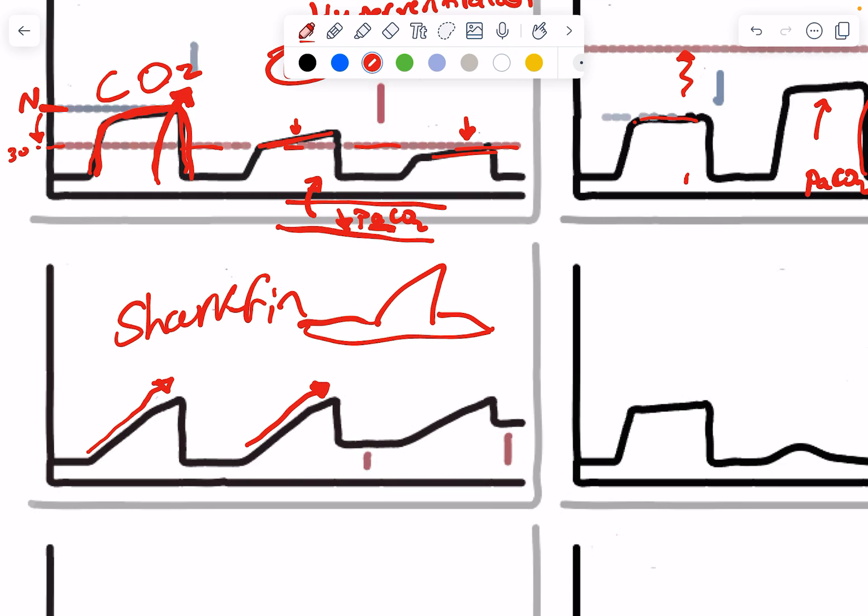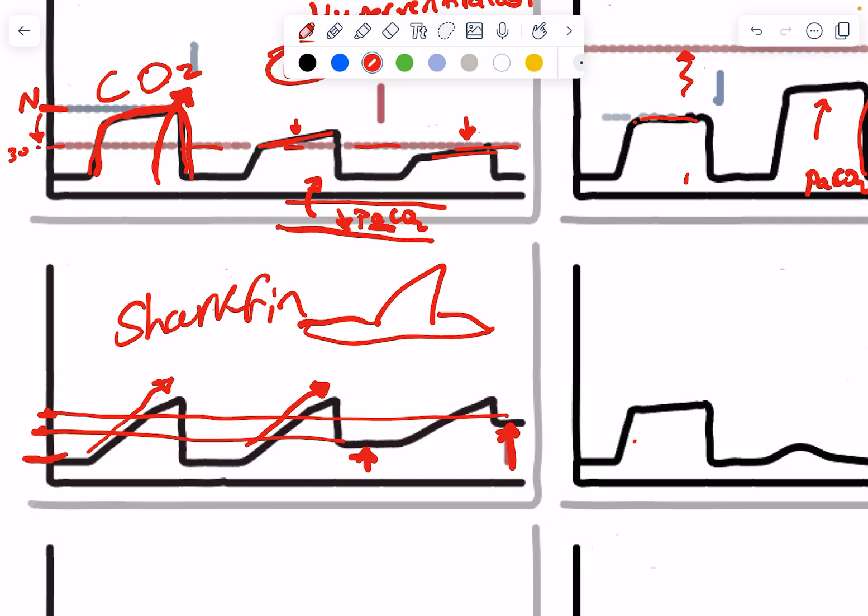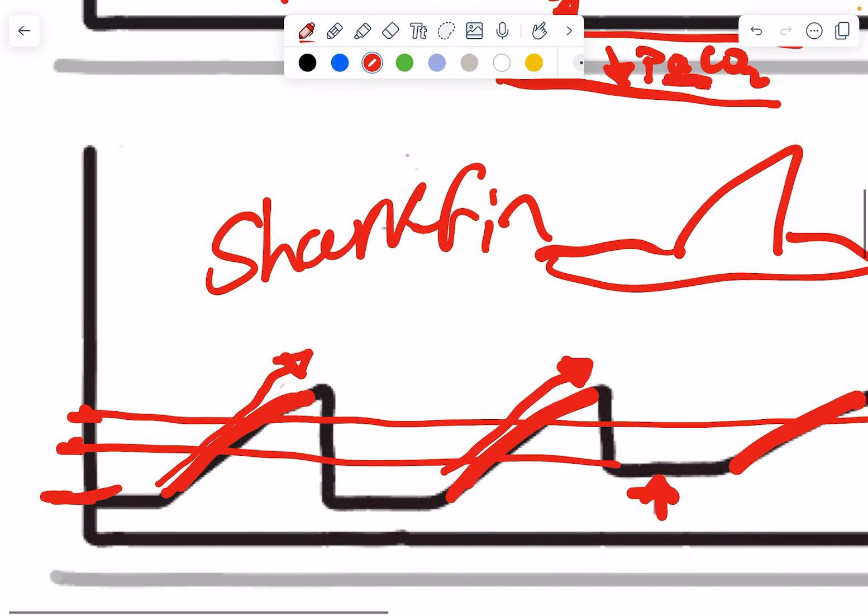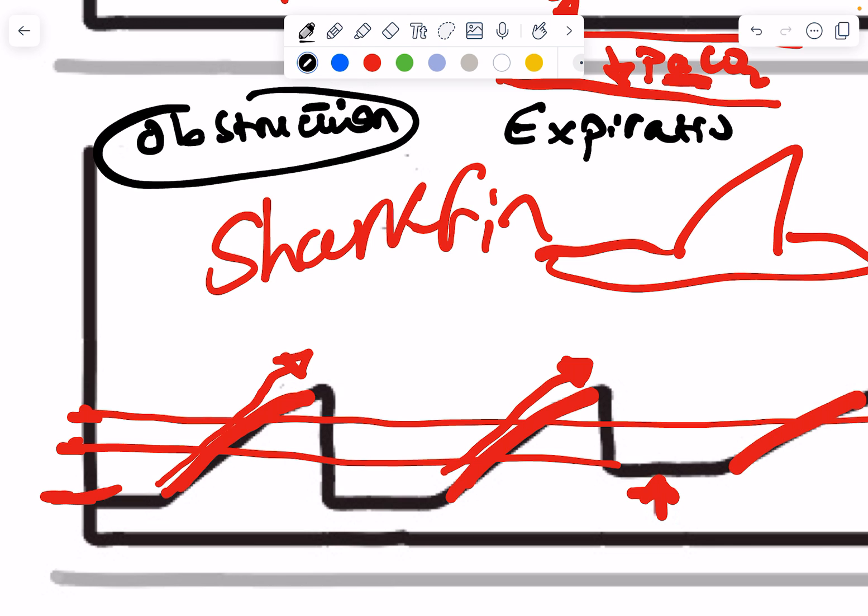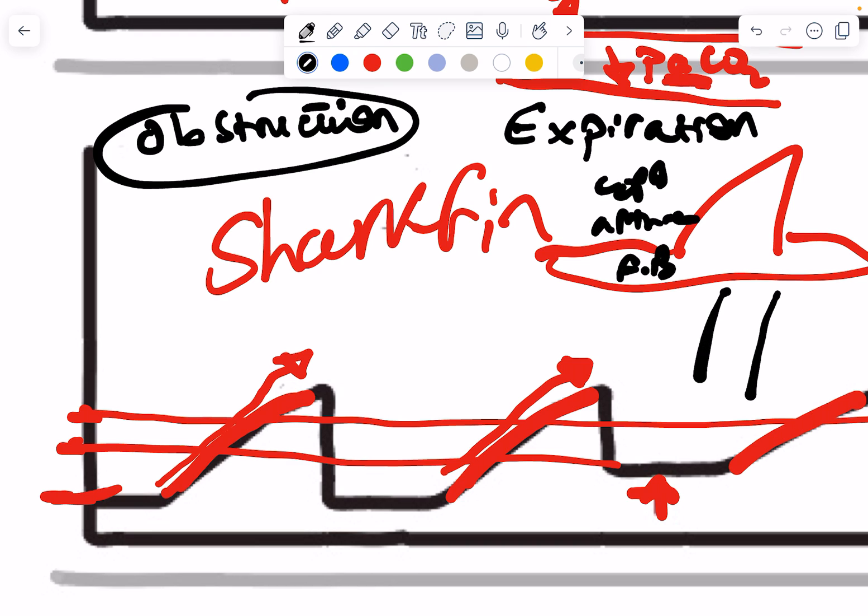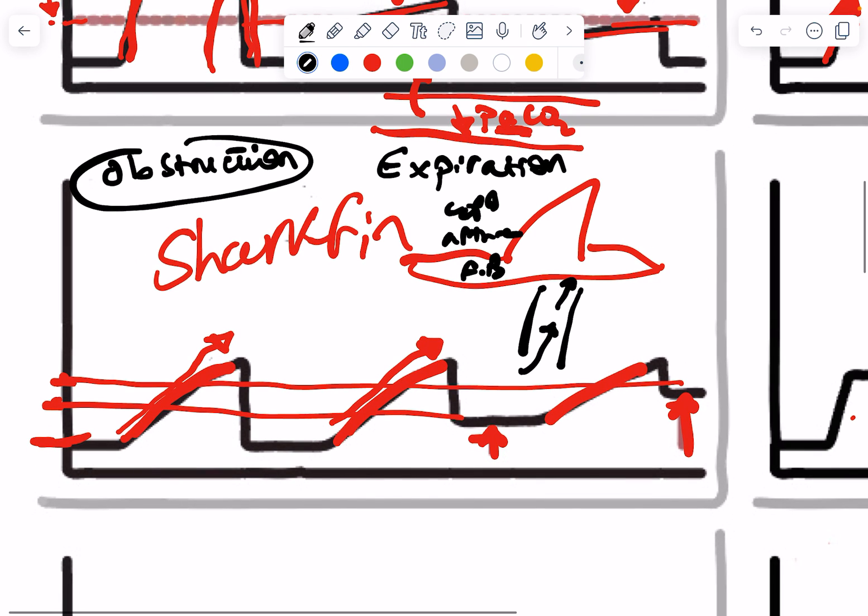It means that this patient is taking much longer to bring out the carbon dioxide than he should. And the baseline of end tidal CO2 is actually going up. He's accumulating CO2 because he has a really hard time getting rid of it. Instead of getting rid of it quickly with an upslope that's really quick, he's taking so much time. The upslope is really slow because of obstruction. So this is typical of obstruction in the airways during expiration. This is typical of bronchoconstriction. Let's say COPD exacerbation or asthma or foreign body or anything in the bronchi and bronchioles that's impairing fast release and expiration of this CO2. And in the end, obviously, this patient is going to retain a lot of CO2 as a result.